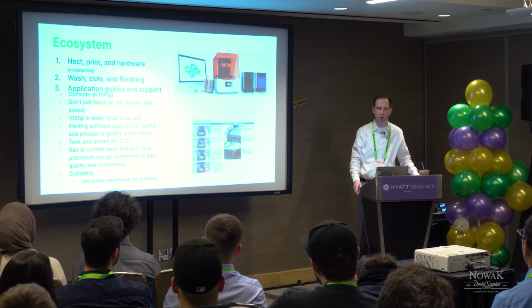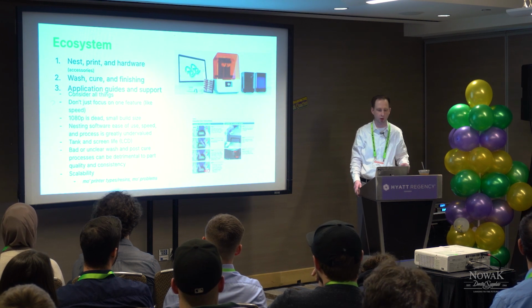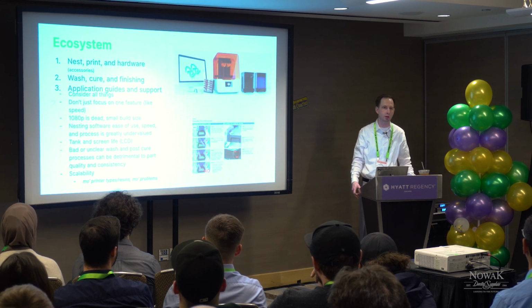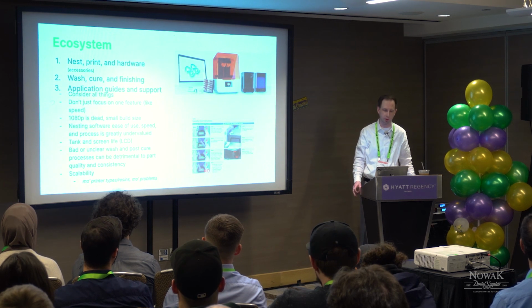It's hard to do, but you have to take a step back and look at every step of the process and make sure it all makes sense, and that there's an answer for it too. A lot of times you put a system in like this and there is no answer, and then you get into the danger zone where you're making it up as you go, and that's dangerous in 3D printing.